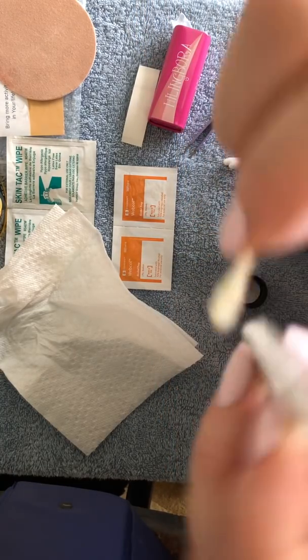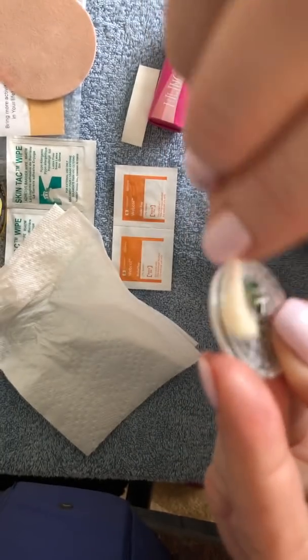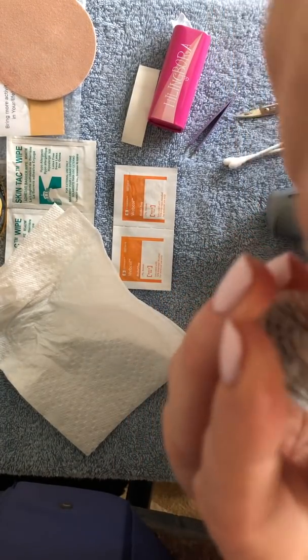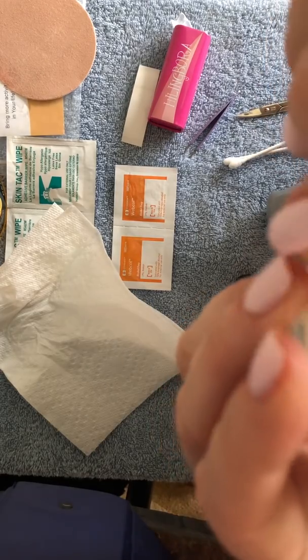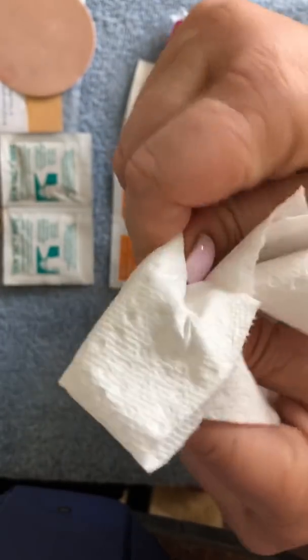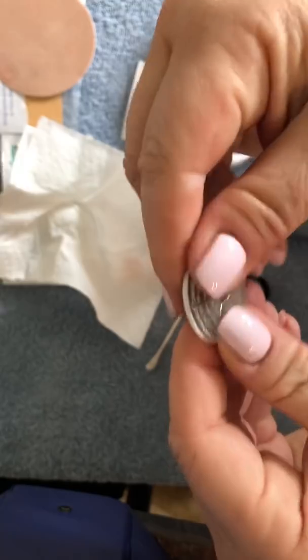And this is really a great fix for the adhesive burning if you have it. I will warn you though, if you call Abbott and tell them you're doing this, they will not replace your sensor. So obviously they're not going to support it. And I know lots of people that have called and complained about the adhesive not working that great and burning, and they basically tell you to go talk to your doctor. So not really helpful. All right, so we're gonna do another swipe to see.